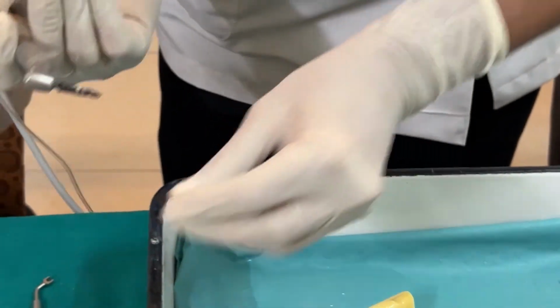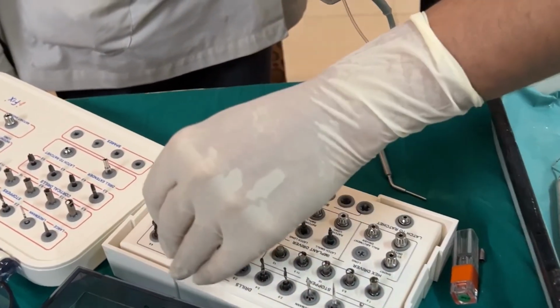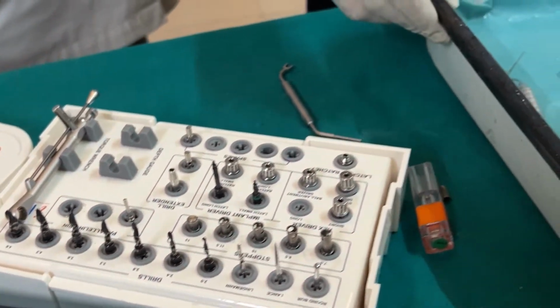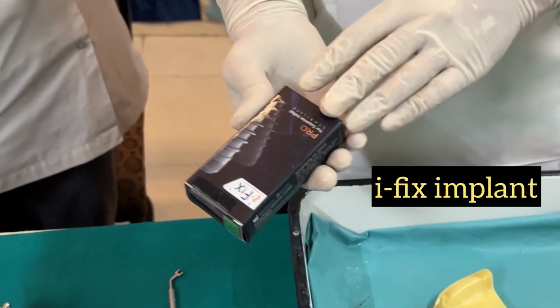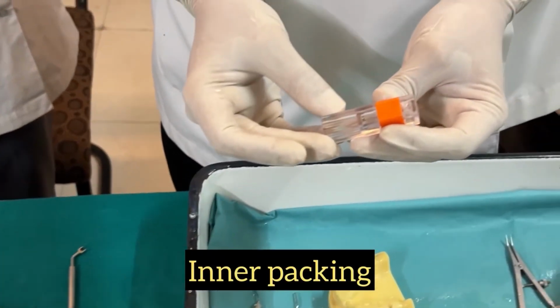So now once it is done, we can just place the drill stopper back, and we can place this thing back. Okay. So now the next step is what? We need to place the implant. So we have the original implants also, but we won't be opening up this packet as such. Implant normally comes, I fix, in this sort of a packet, right?